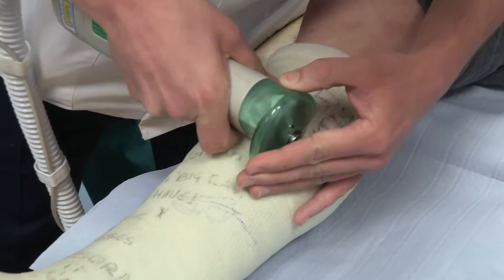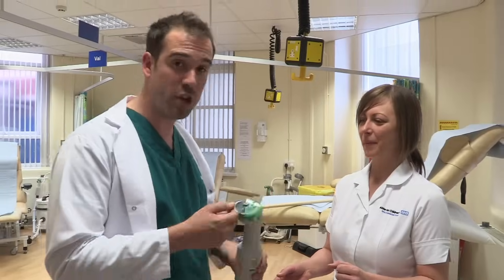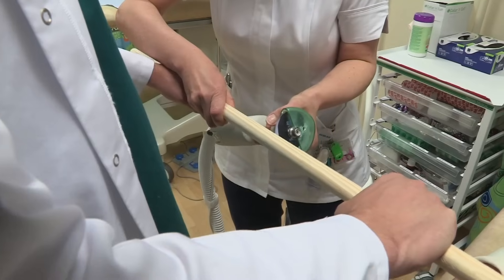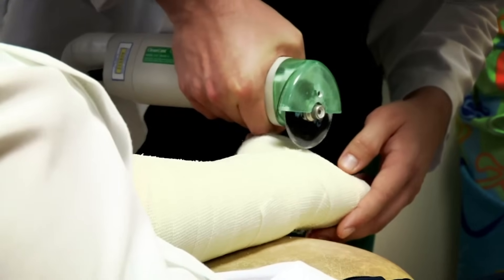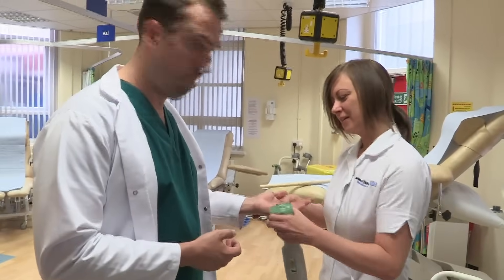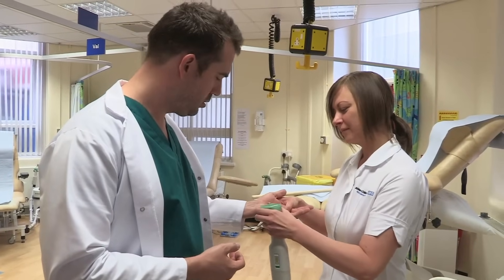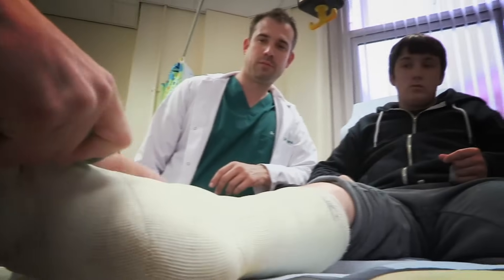To get that cast off requires a saw — but not just any saw. What this saw can do is distinguish between hard and soft things. So it can cut through things like wood or plaster casts, but it won't damage anything soft like your skin. That's because it has a special vibrating blade, so when it's used by an expert it means your cast can be off quickly and without hurting you.